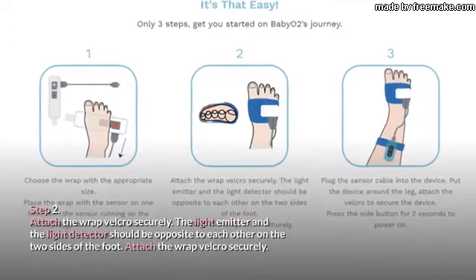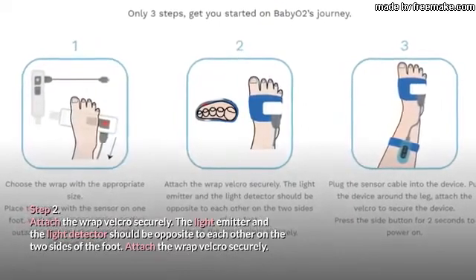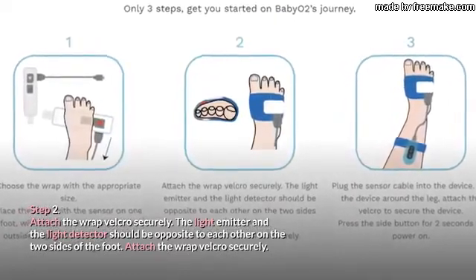Step 2: Attach the wrap velcro securely. The light emitter and the light detector should be opposite to each other on the two sides of the foot.